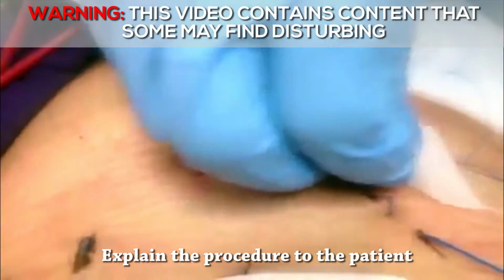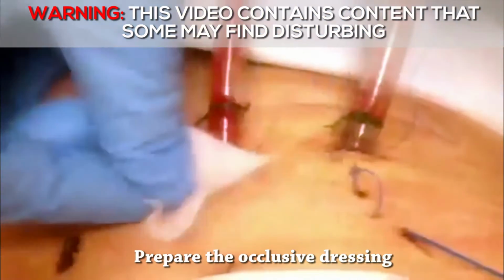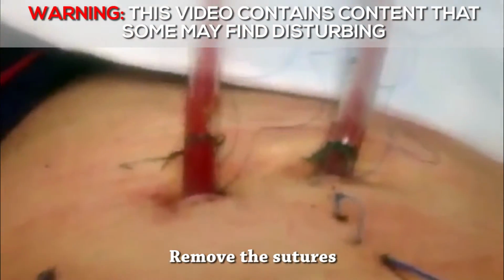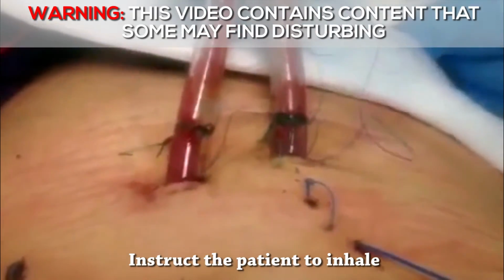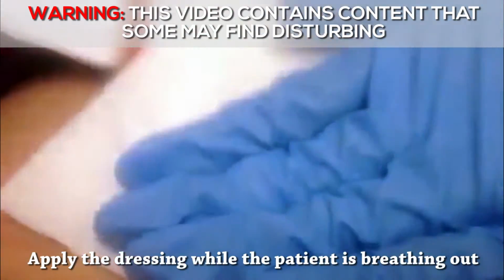Explain the procedure to the patient. Prepare new occlusive dressing. Remove the dressing. Remove the sutures. Instruct the patient to inhale. Pull the tube and apply the dressing while the patient is breathing out.